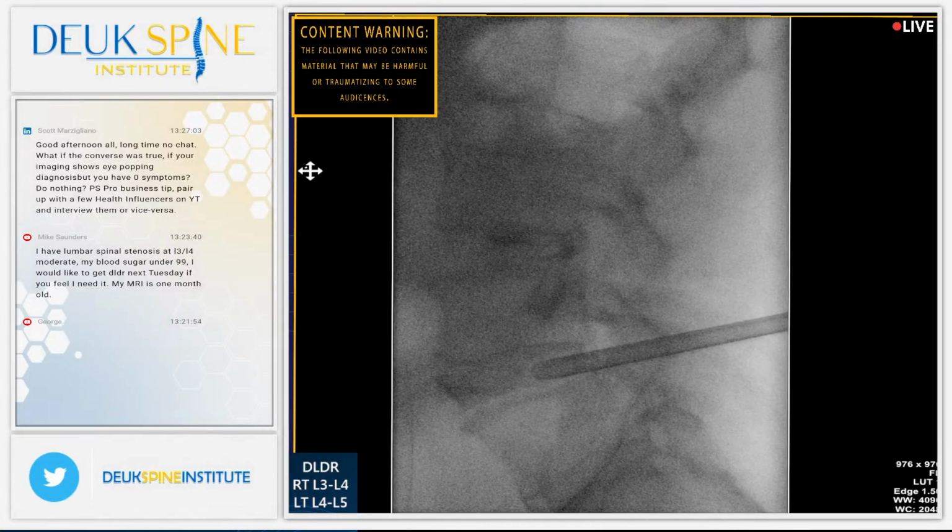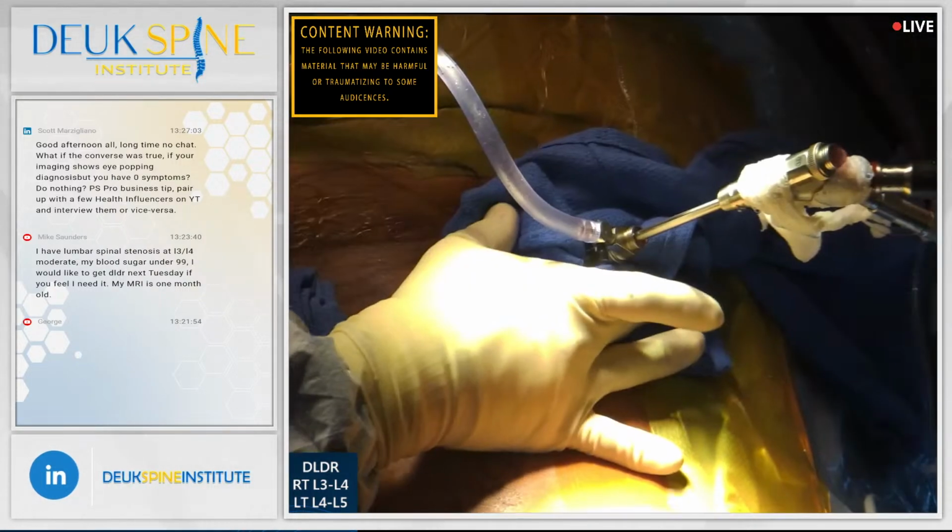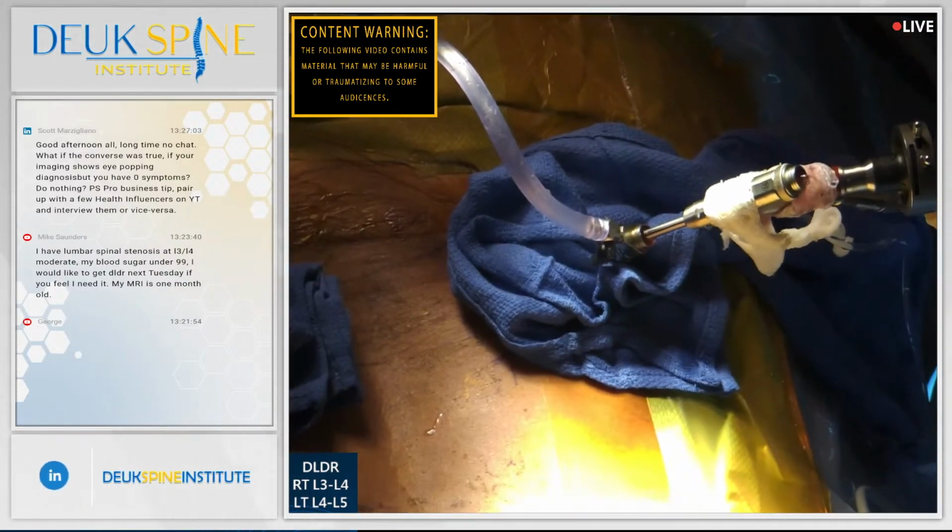We're getting rid of the herniation stuck within the back tear, the tear in the back wall, which happens to be about 2 centimeters thick. The annulus fibrosus is around 2 centimeters thick in this area, and it's torn and it has herniation stuck inside it. That's where all of his back pain and leg symptoms are coming from. That's why we do the surgery. It works. All right. Any other questions?